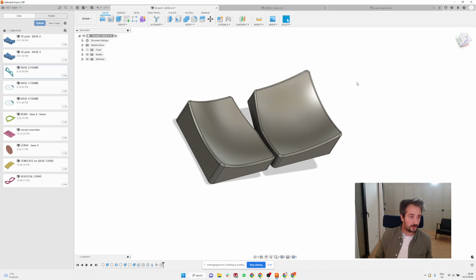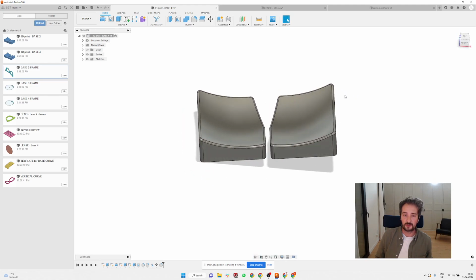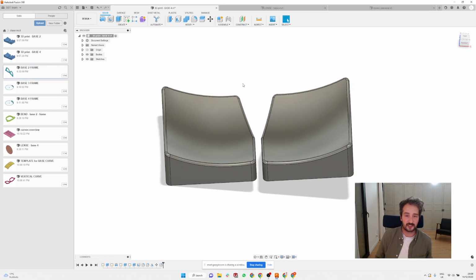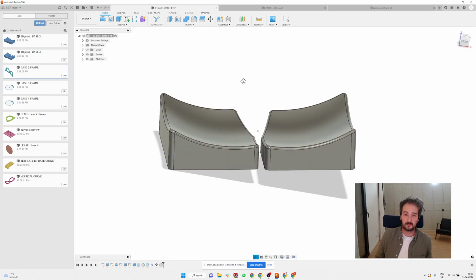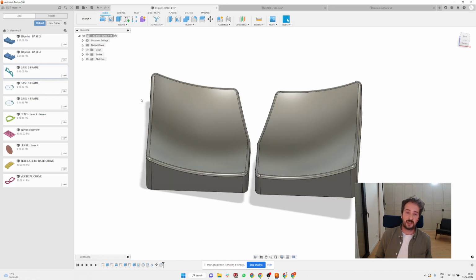So for some people who already have some machines from Italy or from China, you probably recognize this thing, which is basically the mold for a base curve. You always just press the frame against this and it's going to give you the nice curve. And let's take a look at how to do it on a frame. So I can show you how to bend it and show you how it works.